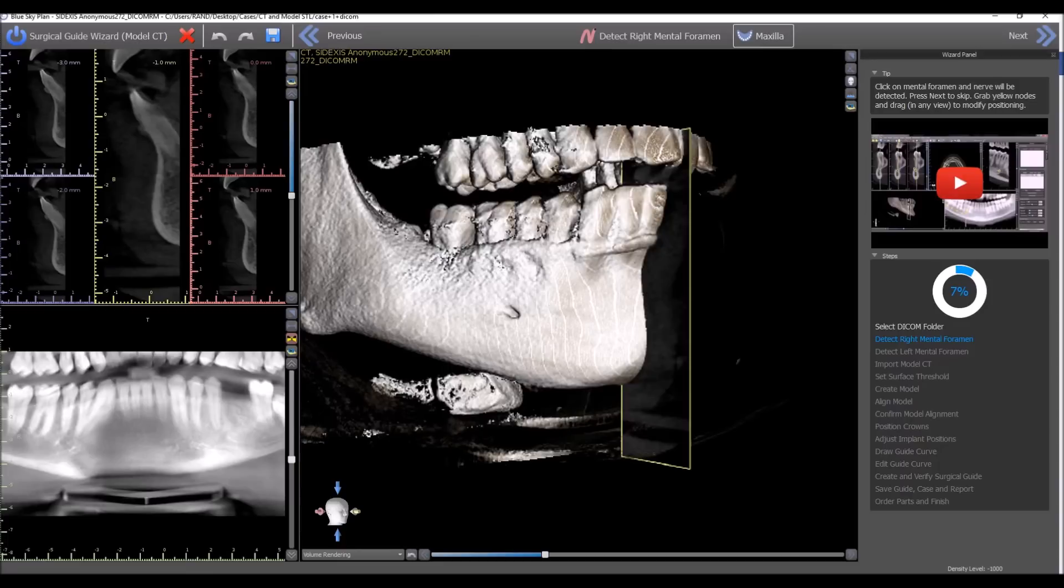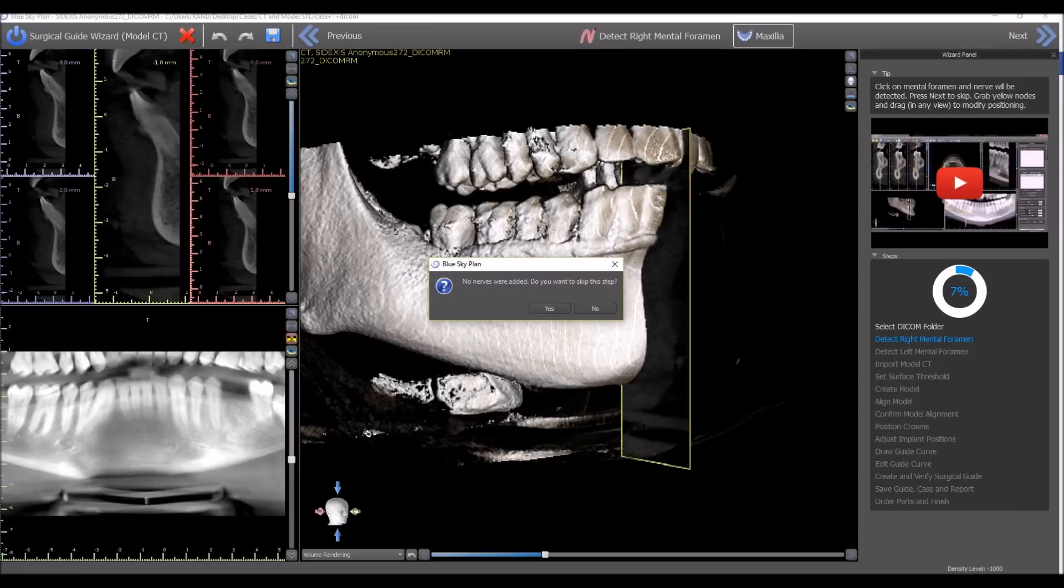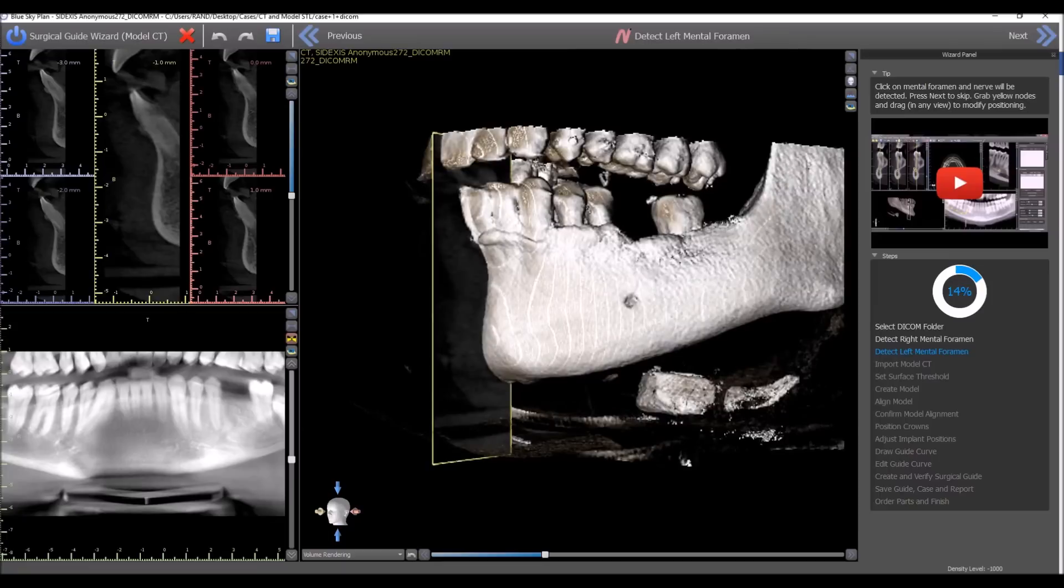Another modification that was made to this build is you don't need to identify both nerves. If you only want to identify one nerve, press the next button, confirmation comes up, but you could skip that step and just identify the second nerve.